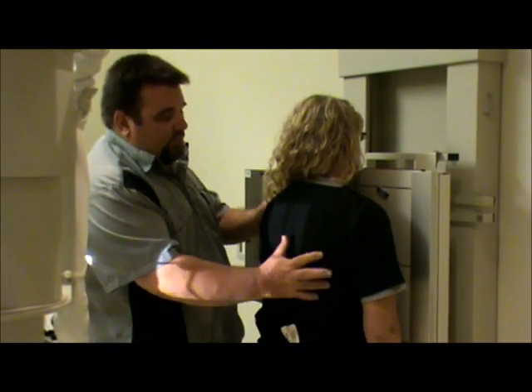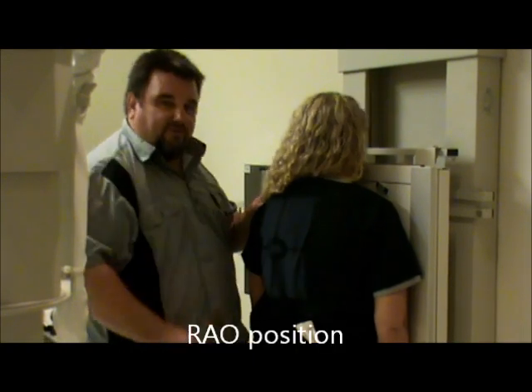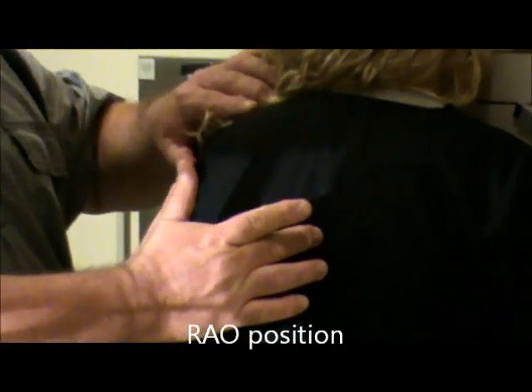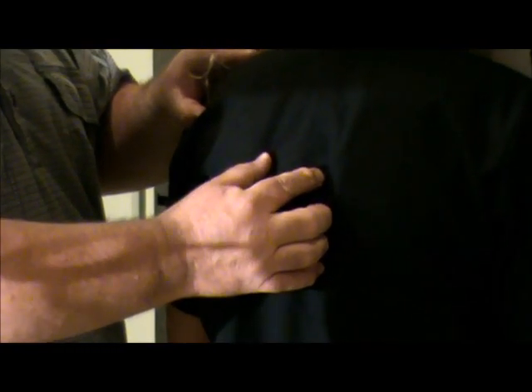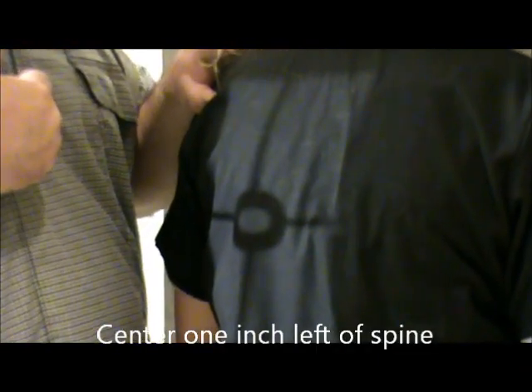The patient is going to be facing the bucky, rotating into an RAO position about 15 to 20 degrees. I'm going to palpate the spine and then move the patient so they're approximately one inch left of the spine. If we do that, that's going to be on the sternum.